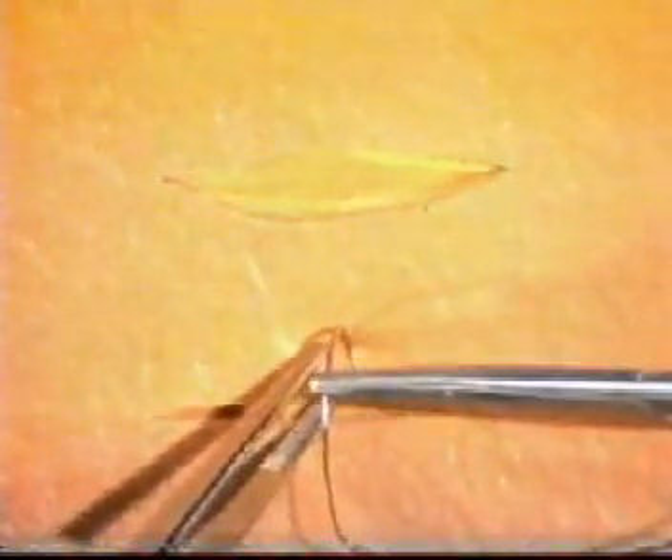If you have to make an elliptical wound, try and ensure that the length of the ellipse is at least three times its width. When closing a linear wound, it may be easier to start in the middle of the wound, as you see here, inserting an interrupted suture and then ligating it.